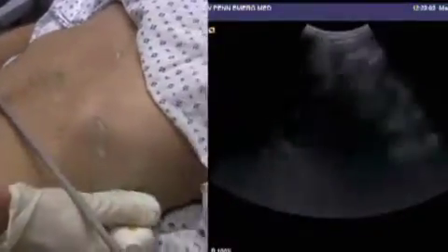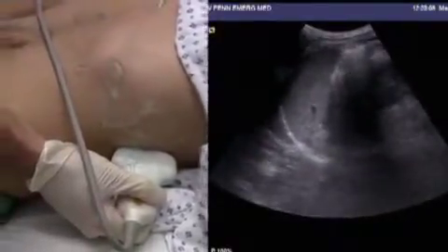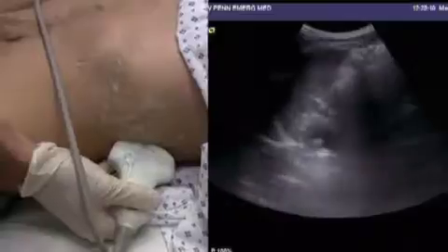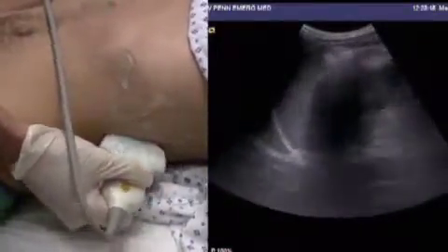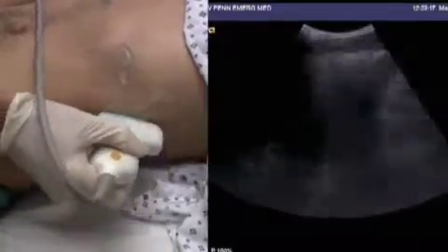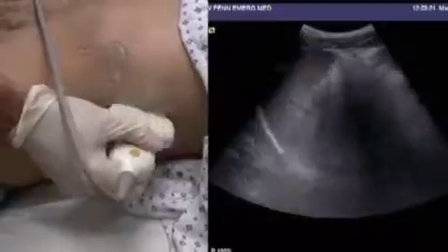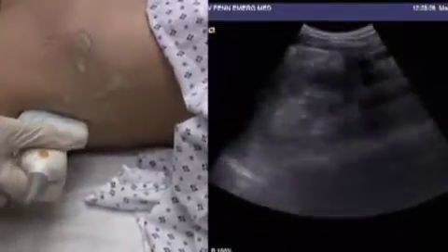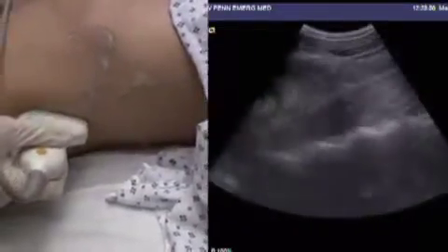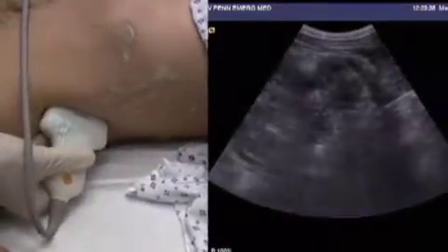Left upper quadrant, adjust depth. Diaphragm, pleural space, all the way through as much as available. Subphrenic space. Splenorenal space — again, a little bit difficult to evaluate. A little bit of fluid right here in the stomach and the splenic hilum there with the vessels. The rest of the kidney has no fluid around it. Inferior pole of the kidney right here, examined all the way through the inferior pole.